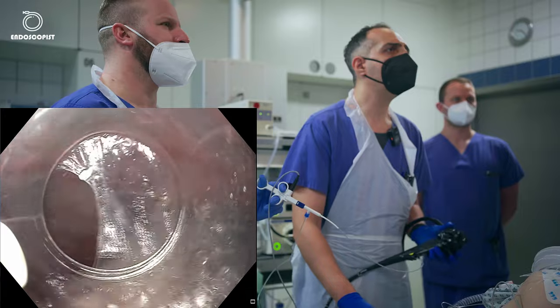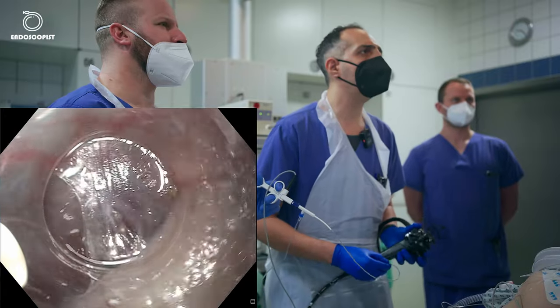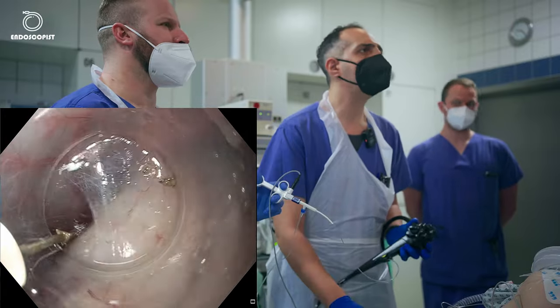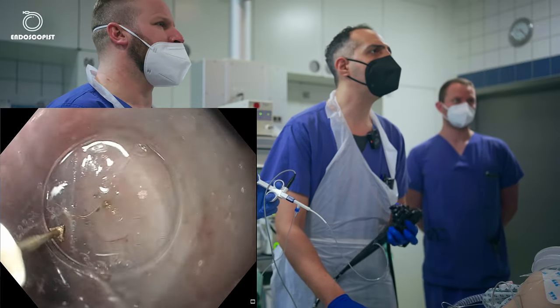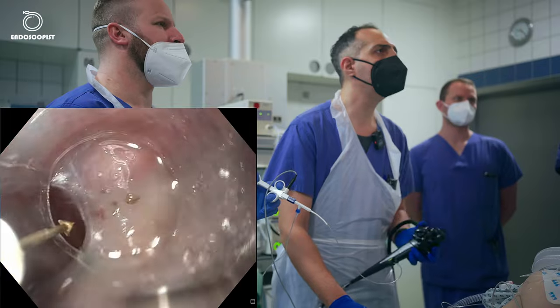In this area, you don't have good separation between the mucosa and the muscle layer. It's sometimes because of adhesions. So we have to be cautious in this situation.